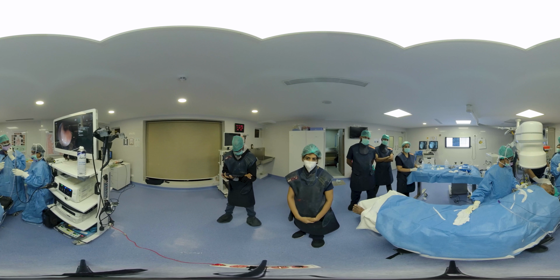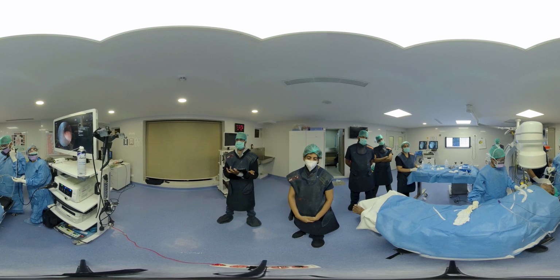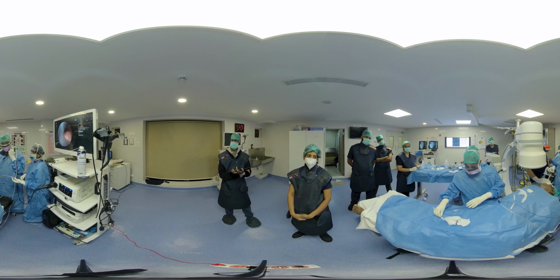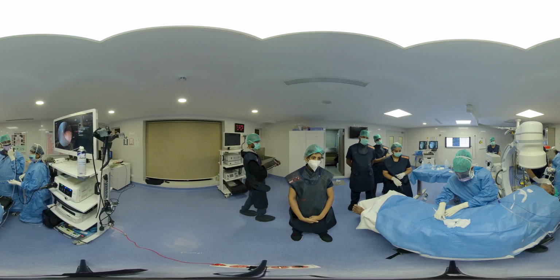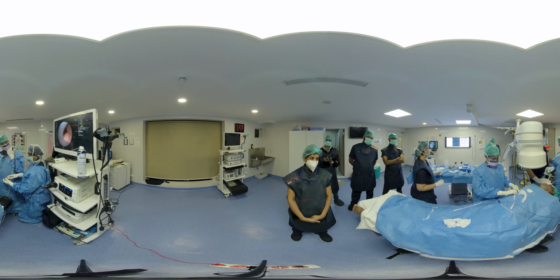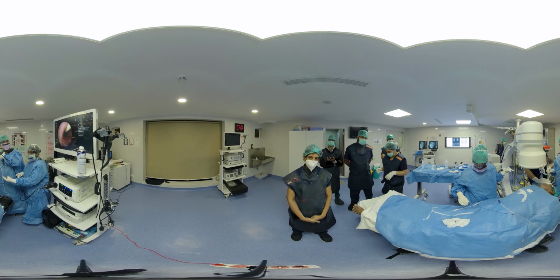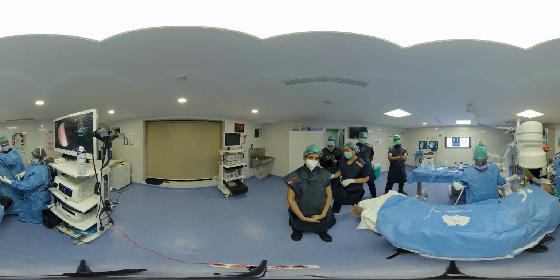Once it is done, the next important thing is we need to position the Fogarty in place. So what we are using is a Fogarty balloon technique. You have an accessory channel in the scope, so we are introducing the Fogarty balloon there, and we want to position it into the right upper lobe bronchus.